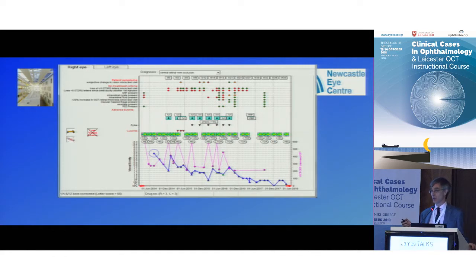So if you have got somebody who's ischemic and you start the injections and then you decide to stop, it may be at the time you decide you're going to stop, you need to reassess and say, is this at risk? Do the fluorescein maybe, or make a decision. Does it look like this patient's at risk of rubeosis? Should I laser them rather than just leaving them and waiting until it happens? I don't know the true answer to that, but that's my impression.